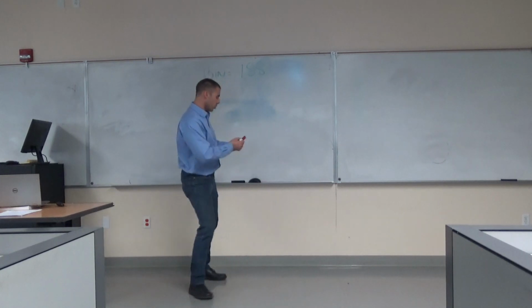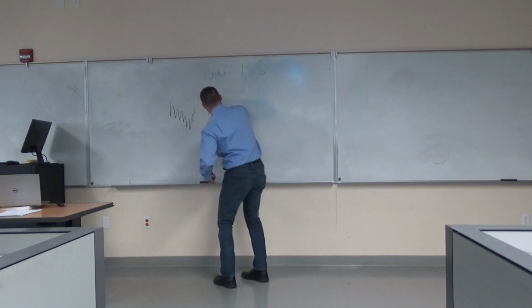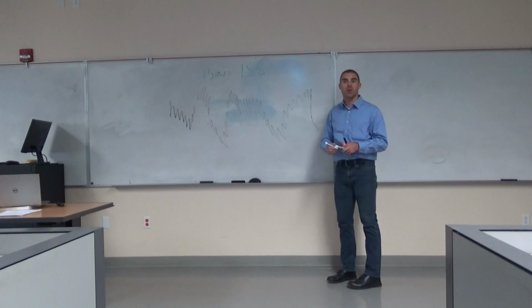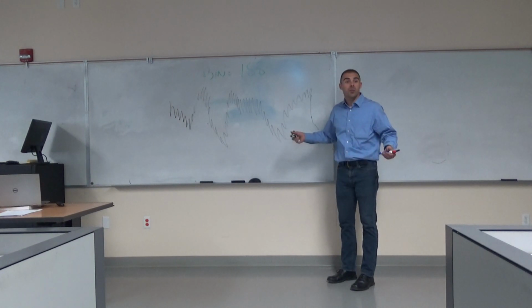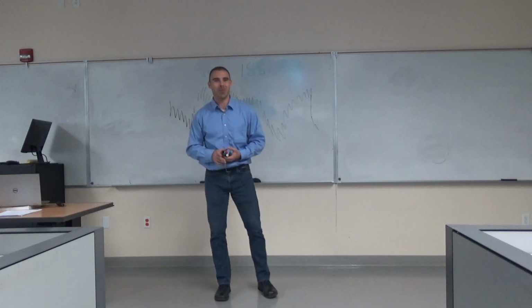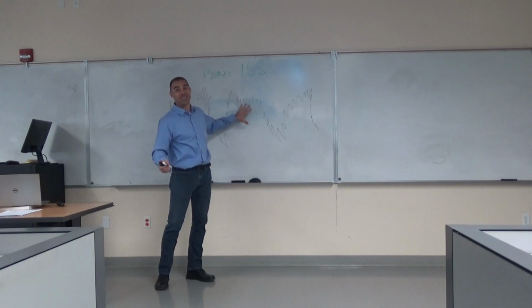And so when we look at EEG data, right, it kind of looks like this. Right? Because biology is really messy. Brain activity looks like this. Right? And it should. How many of you guys want your brain activity to look so clean it looks like a flat line? No. Yeah, right? This is a time when you want it to be messy, okay? So you want there to be lots of different activity going on, trust me.